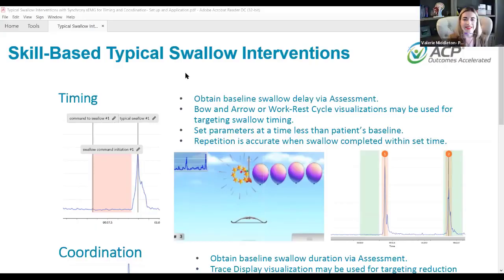Thanks so much, Lynn, and thank you all for joining us this afternoon, and I hope everybody's having a great week out there. As Lynn mentioned, our topic today is the use of Synchrony biofeedback to address typical swallow interventions. We could spend a lot of time on this because there are many options with typical swallow, but we're going to hone in on a couple of areas today, looking at working on a patient's swallow initiation timing, as well as their swallow duration and minimizing excessive activity.